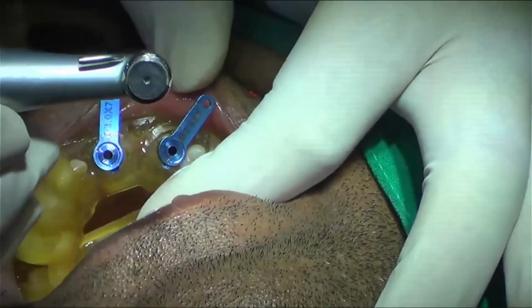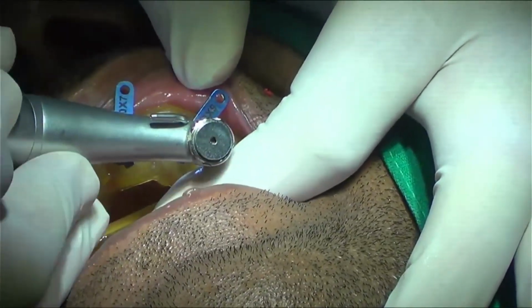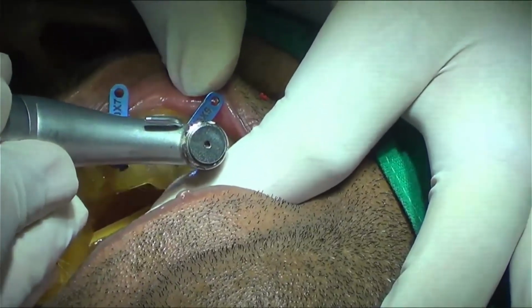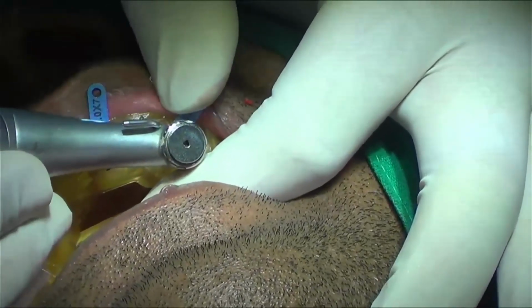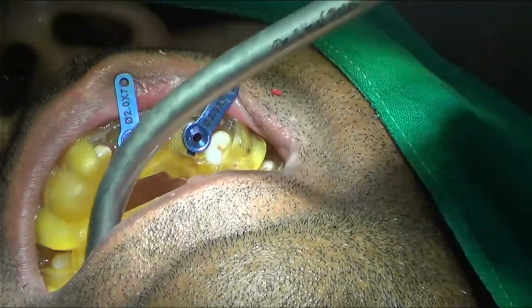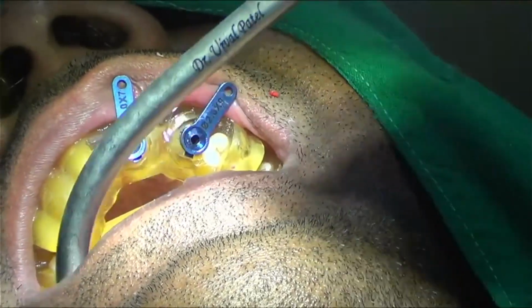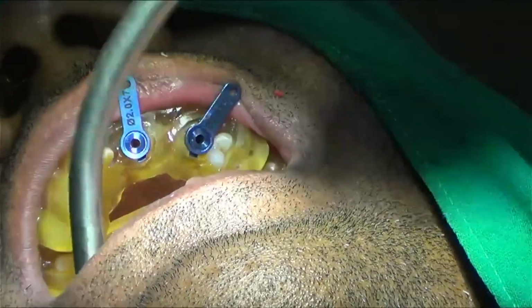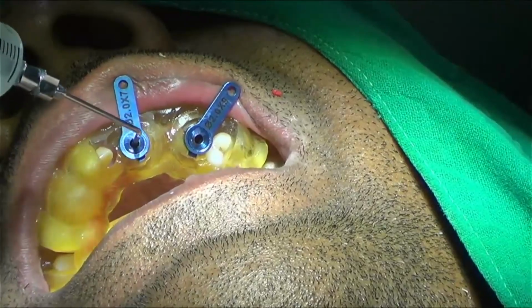I am not starting it before taking it inside. I first go inside, hit the bone, then start my drill and take it out. So this is how you have to do the drill. From the feel of the bone, I can say that the bone is approximately reaching at least this 5 mm.